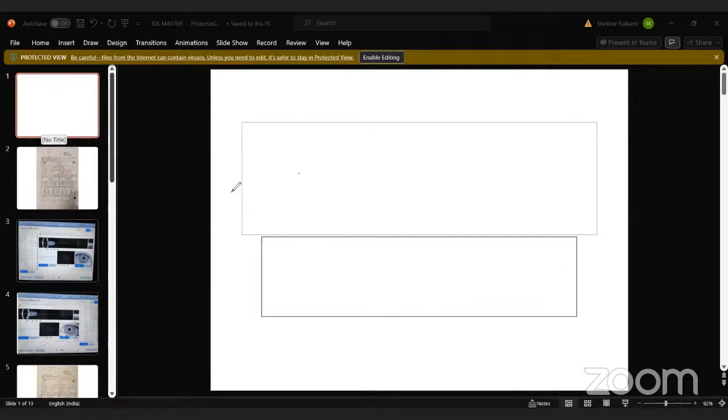The patient's alignment to the machine is very important because we use the fixation of the eye to measure the axial length or other measurements like corneal surfaces and the anterior chamber. That fixation is very important.